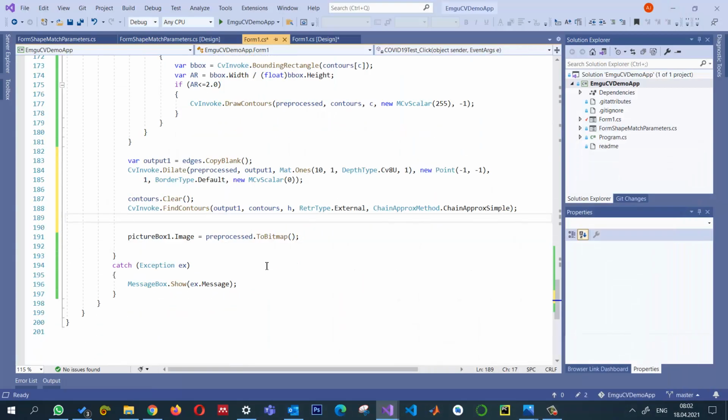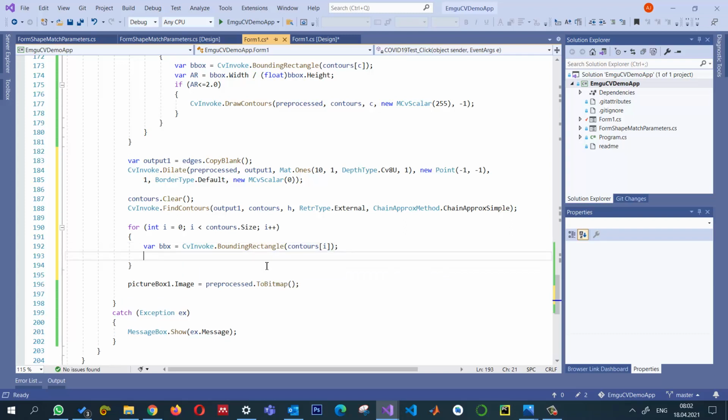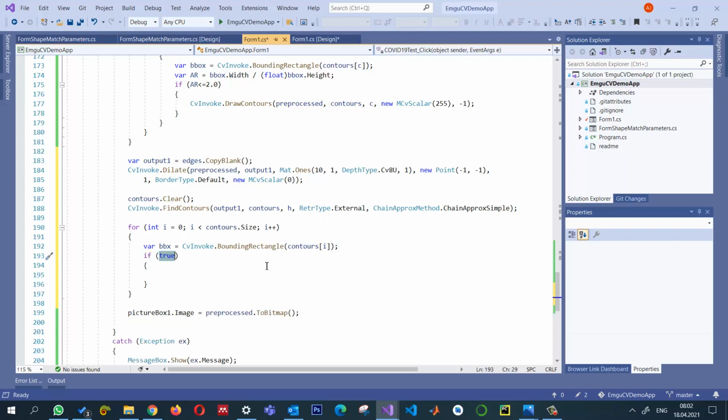So I'm going to write a for loop for i equal to 1, and we have contours dot size, and we need the bounding box for each contour. So I'm going to write cv invoke dot bounding rectangle, and for these contours, the ith contour, we get it. And once we have the bounding box for each contour, then I can write the condition: bbox dot height is greater than, if height is too much greater than, let's say the bounding box dot width multiplied by 3 times. If it is greater than 3 times, then we consider that a strip because we don't have any other object that has something like this.